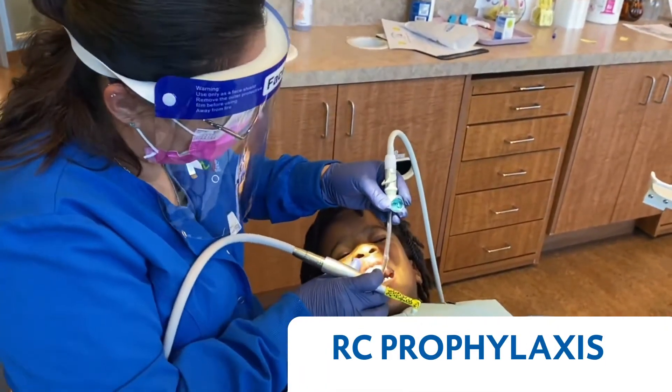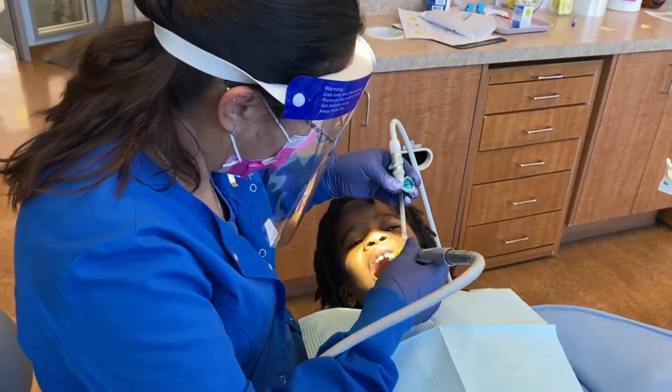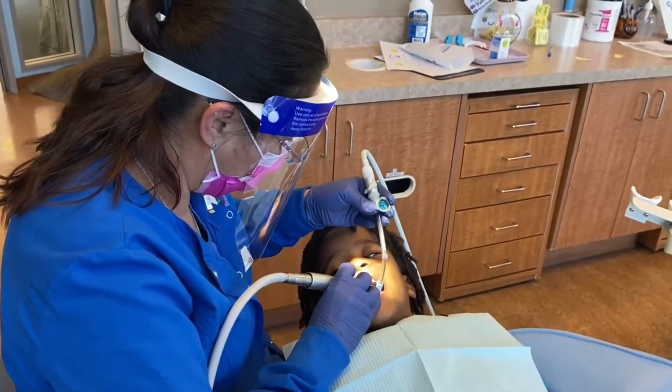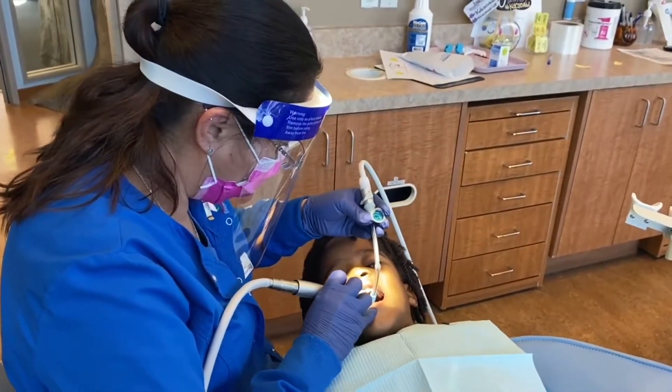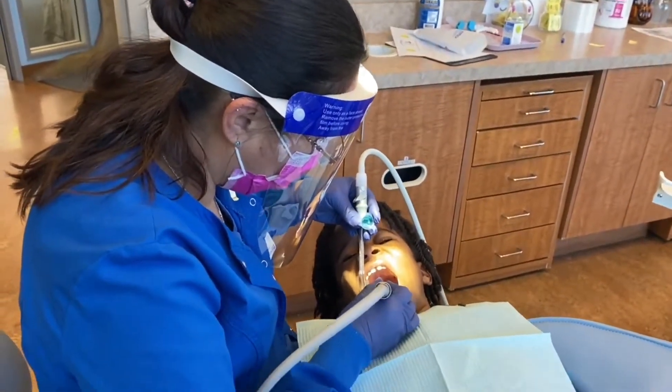Our little four-year-old friend is going to be getting his prophy, after which we'll be able to apply fluoride on his nice shiny clean enamel.